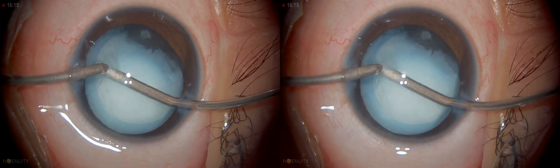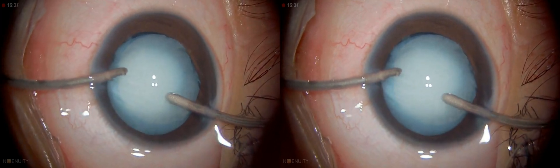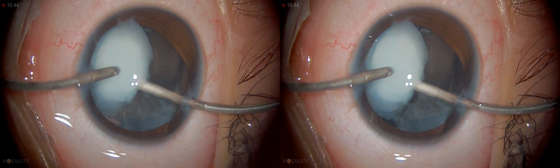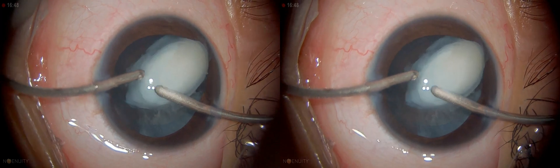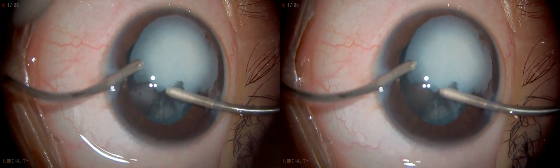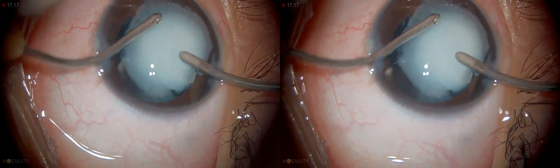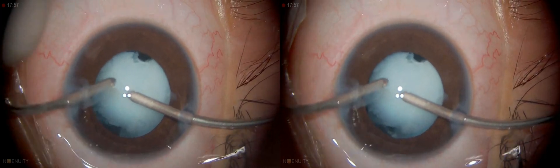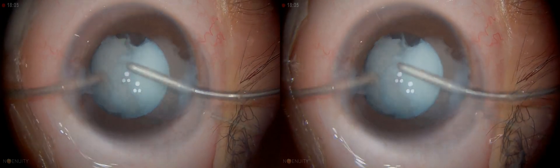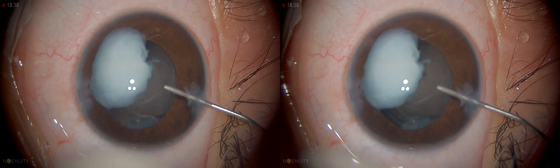I aspirate the periphery first and then come to the center. You should be able to turn your port wherever you want — this 360-degree movement is very important. As you can see, as I'm taking the superior part, the whole nucleus is there. It's a very soft one most of the time, but this is a little bit leathery and not aspirating completely. It's definitely leathery — that's why it is not intumescent. At this point it's probably best to pause. Inferiorly at six o'clock you can feel the whole nucleus. This is not the typical material that will come off very easily, so I will use a little bit of phaco energy to take it out.